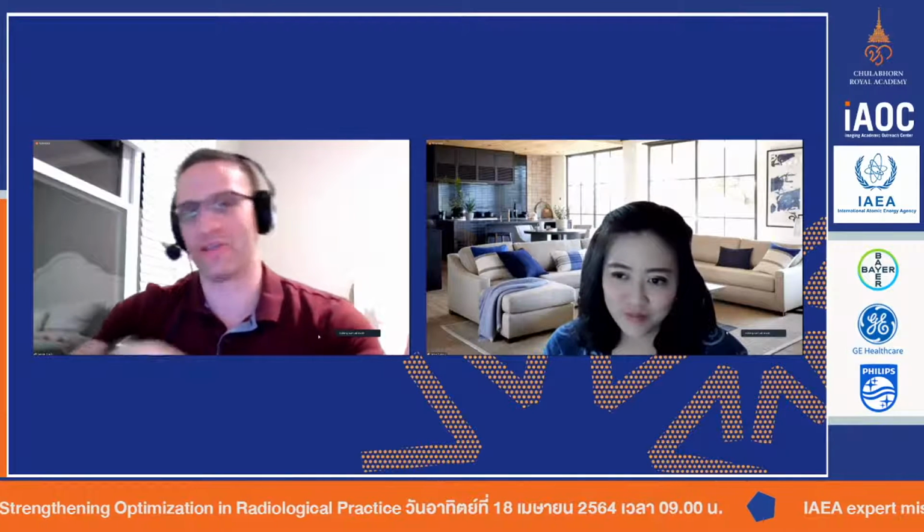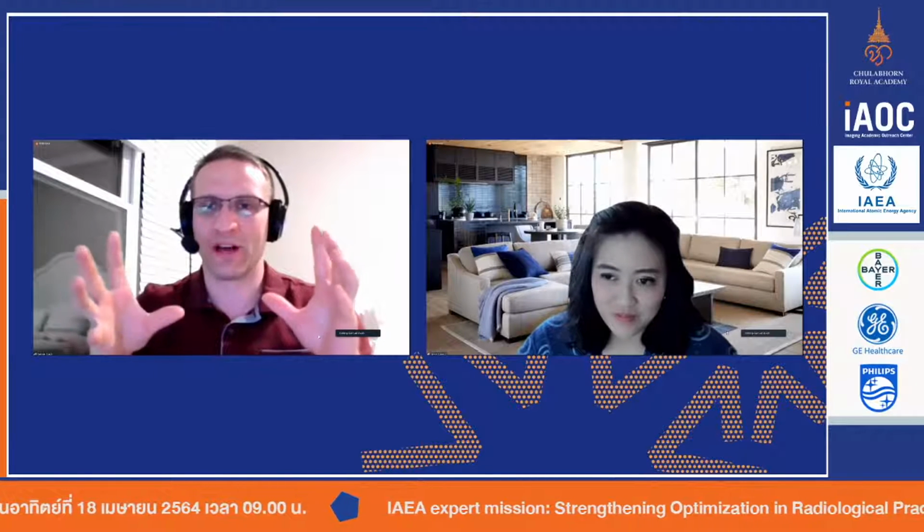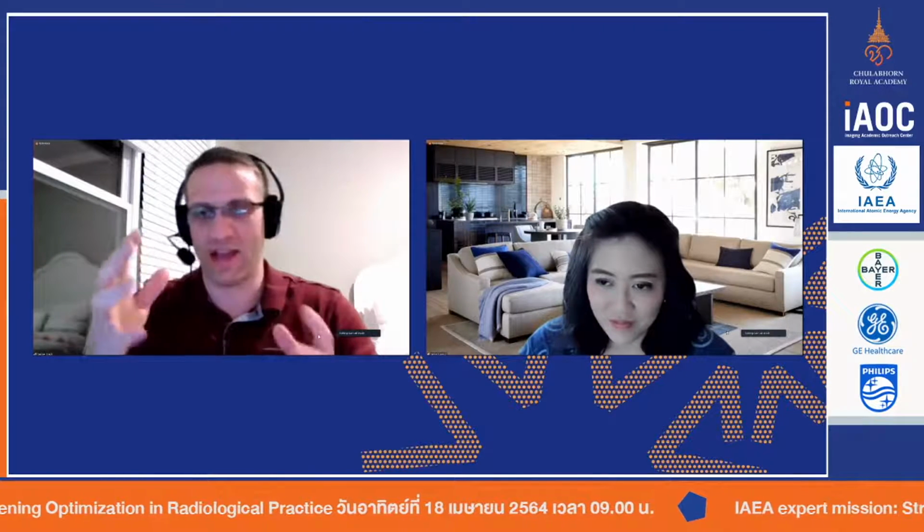There are a lot of tricks because now, so the next talk, we'll talk about how the system actually puts the image together based on resolution, contrast, and noise. But there are a lot of different types of knobs. We don't have a KV knob. We don't have an MA knob, but we do have other things we can do, which we'll talk about in a minute. For example, we can change the distance of things, and we can change how fast we acquire the image. We can change the rate, and a few other things, which we'll talk about in a minute.